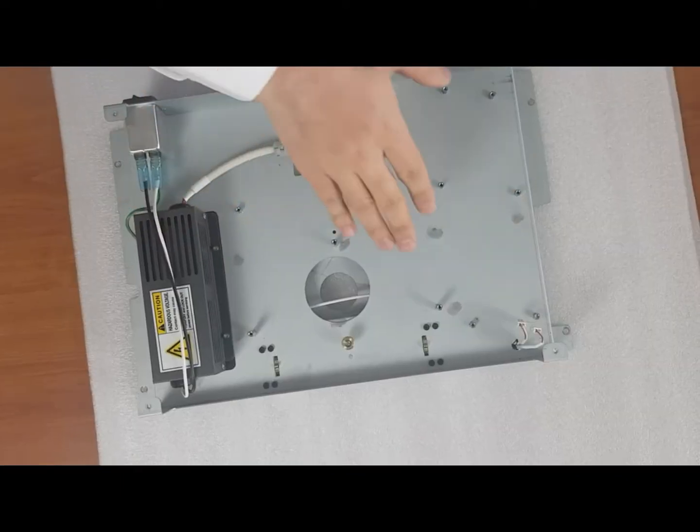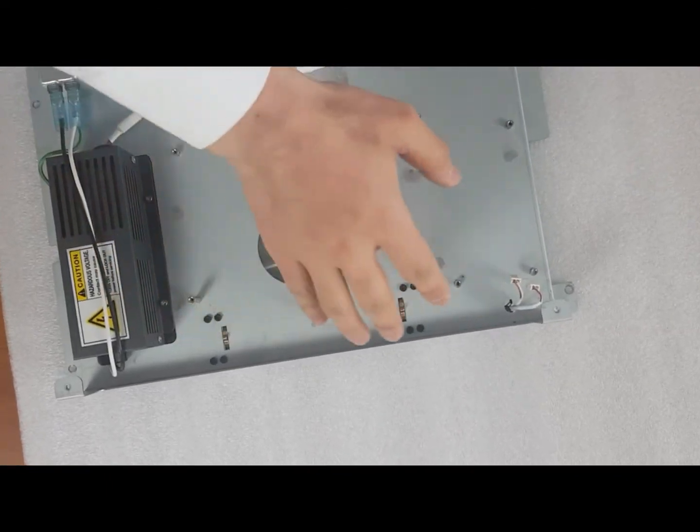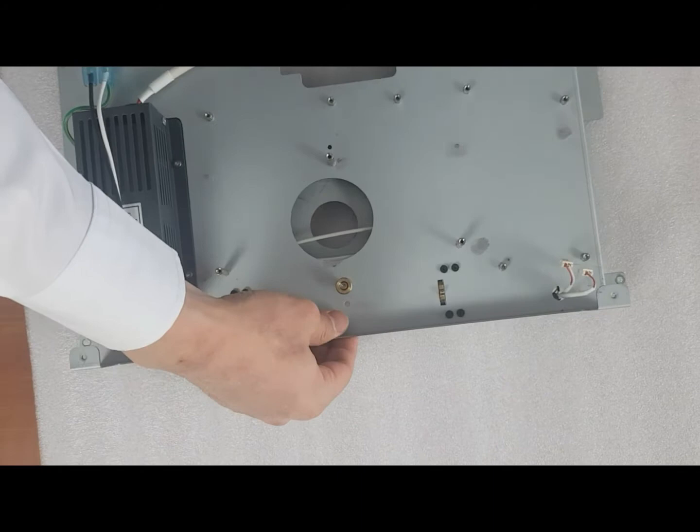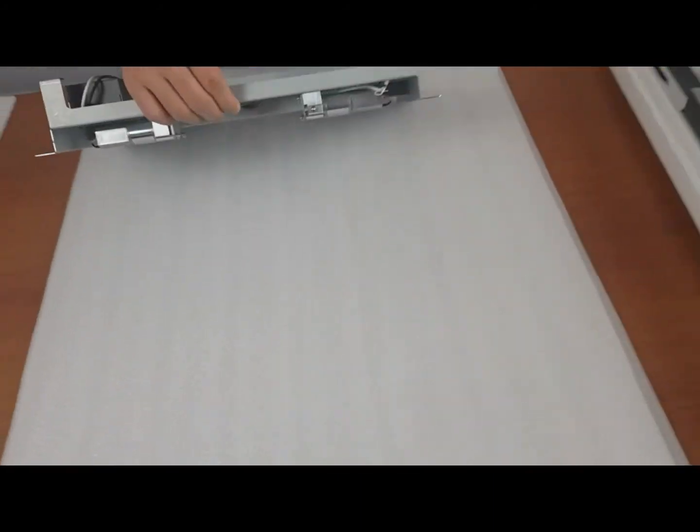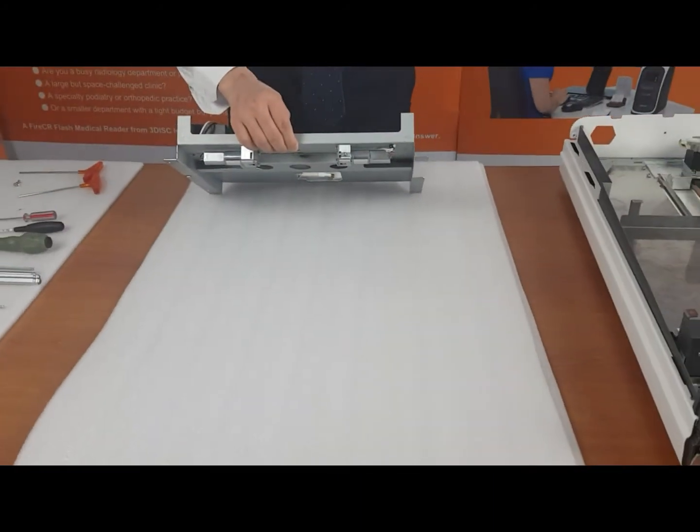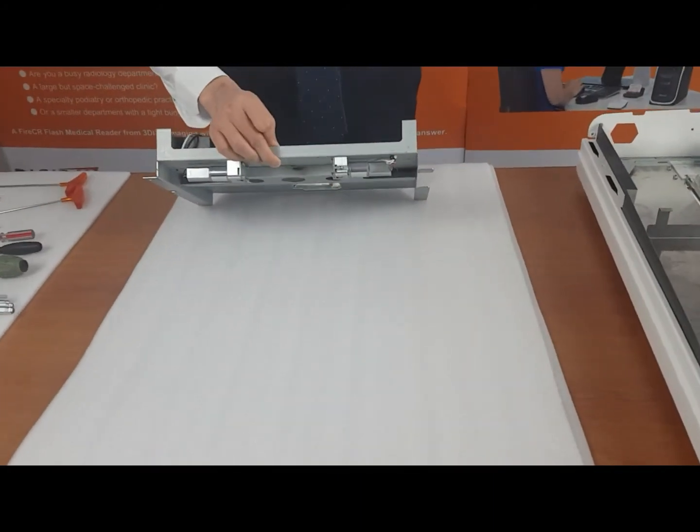As you can see, the align motors are right here, attached to the board.